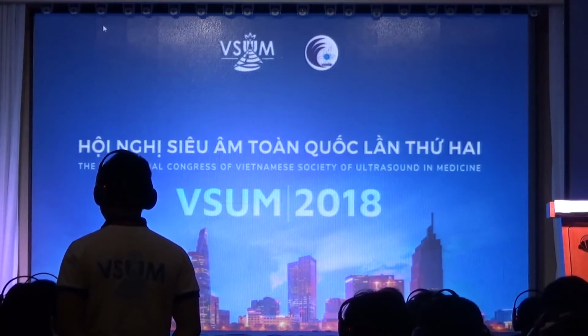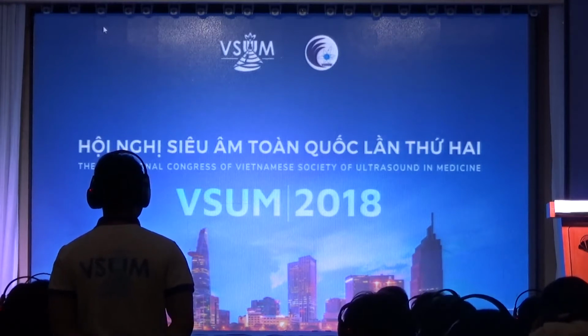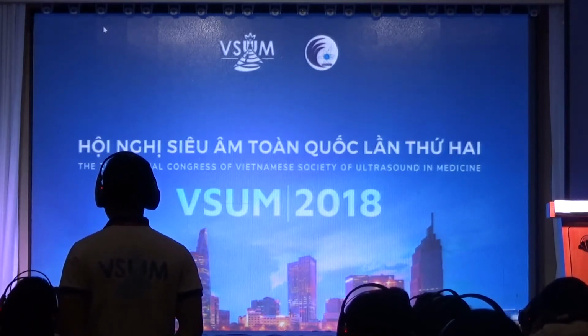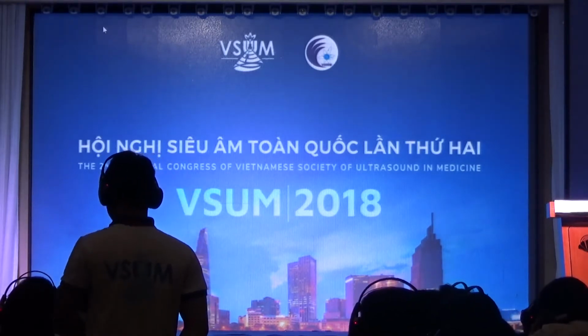But I think that's another easy way for you to know what the clinician needs to do, as opposed to saying it's F2. You can say some people can have cirrhosis and still have very low stiffness values. So it's not just the stiffness value, it's putting everything together in one picture.